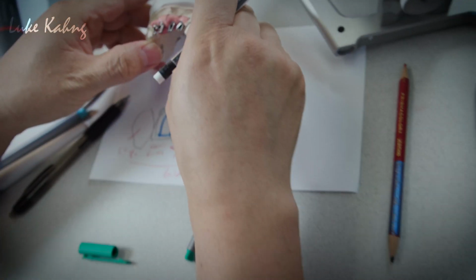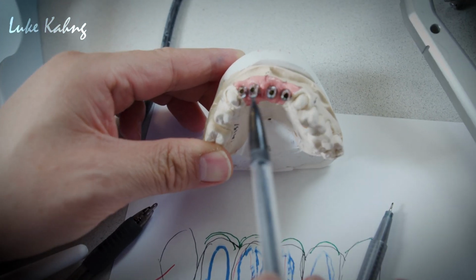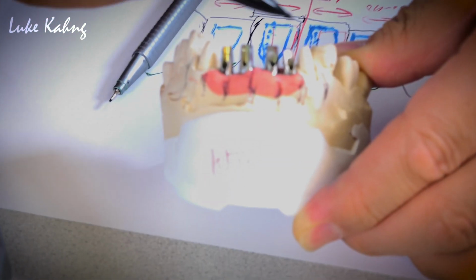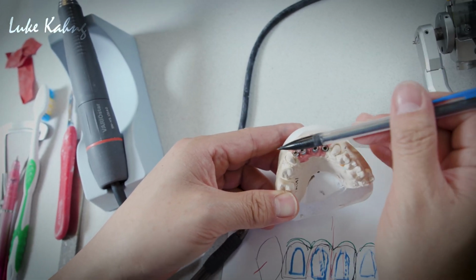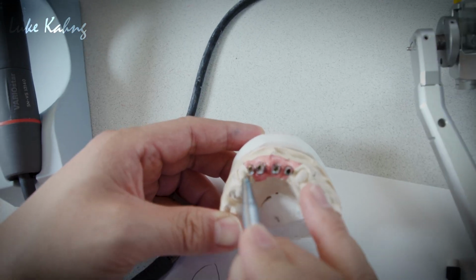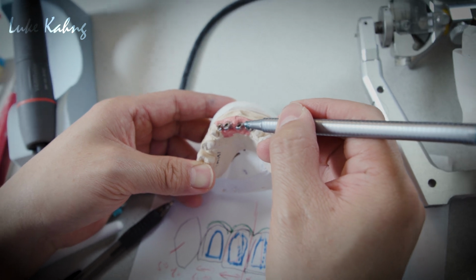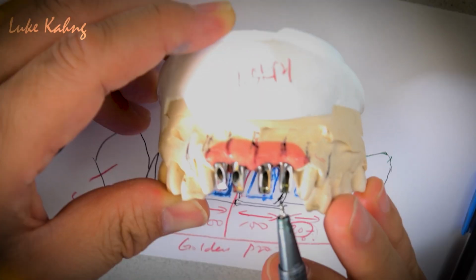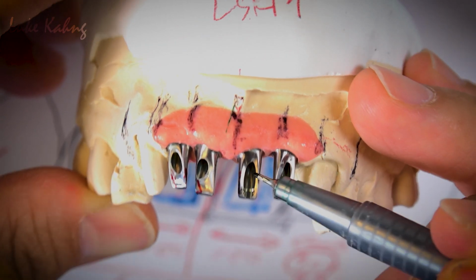Okay. Number two, then you see the alignment. I have seen the alignment just like that. So we're trying to bring in as much as possible because I don't like the grayish see-through from inside. Because if I make the zirconia, I want kind of a little bit of a line of the occlusion line. Since this is under contour, which is fine. If I roll them, I make a little bit out, just like compared to the same. That's the best. Then I can make the zirconia thicker, then we hide underneath.